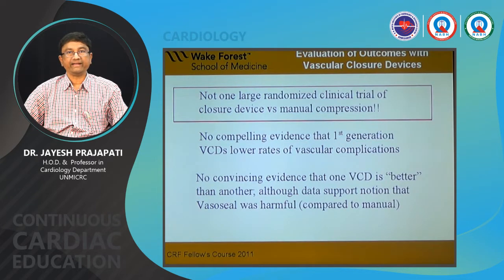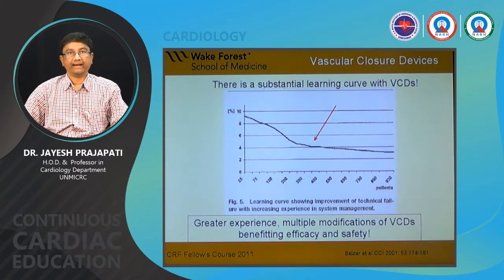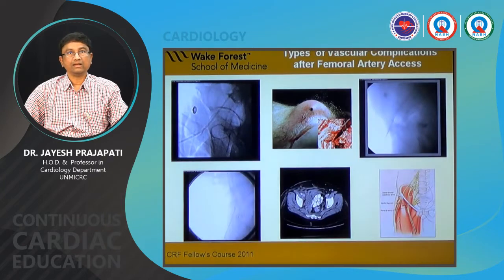So you should be familiar with vascular closure devices. You should also know the complications or the limitations of the vascular closure devices. But of course, there are some advantages: a large bore puncture can be closed easily, and the patient can be mobilized easily after 2 to 3 hours. So for an aged patient it is a good thing. So everyone should learn regarding the vascular closure devices and their complications. Experience is a must for vascular closure devices. And some complications can occur with the devices. A large size hematoma can occur.